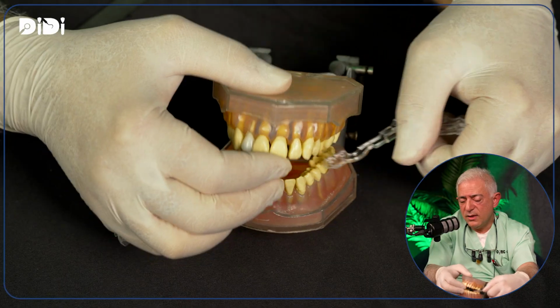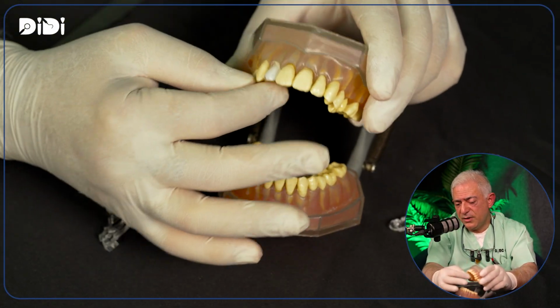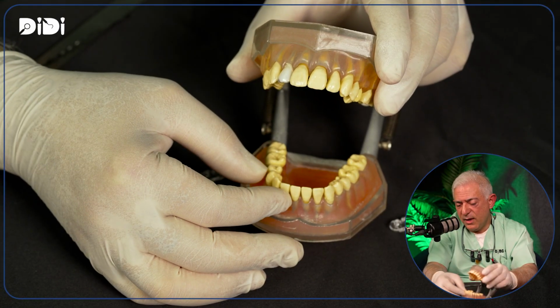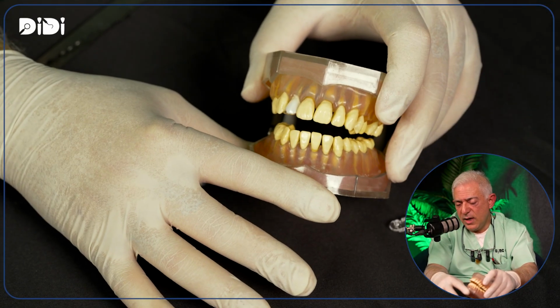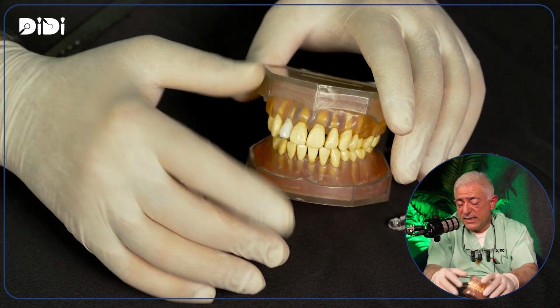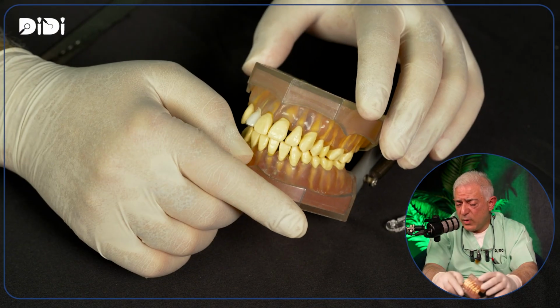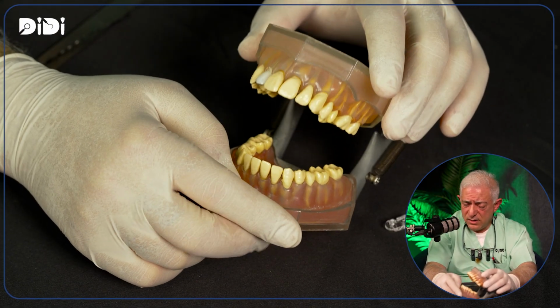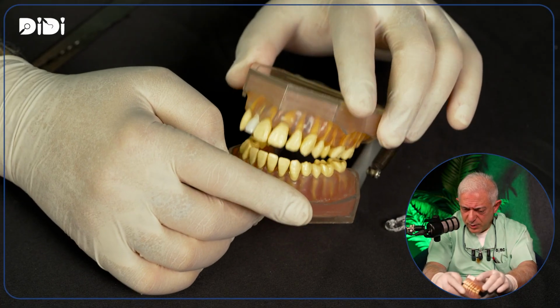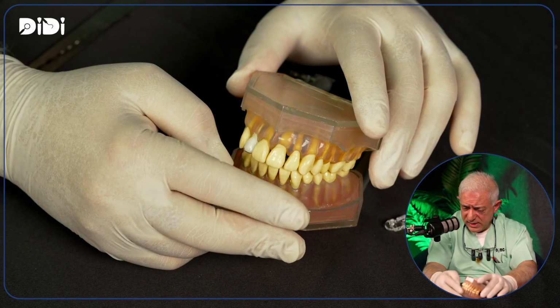Of course, the lab has to be familiarized with this concept that they will increase 1.5 millimeter from the maxilla and 1.5 from the mandible. And this way, you have ideal vertical dimension increase, centric occlusion sent to the lab. So there is no reason to wait 21 days or 45 days for the patient to get used to this, because this will always be comfortable for the patient. Up to 5 millimeter is a safe distance.